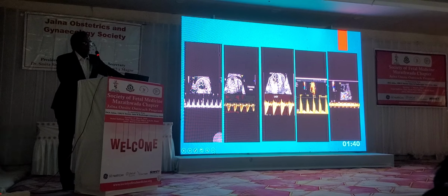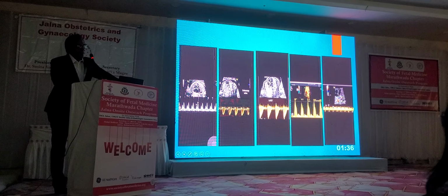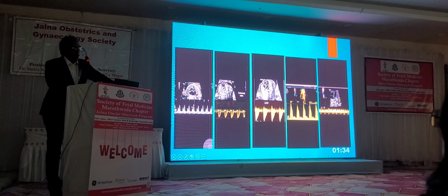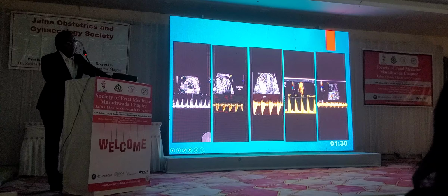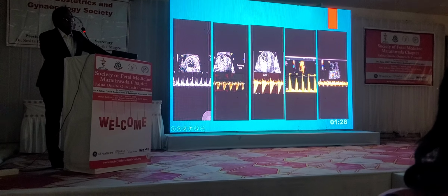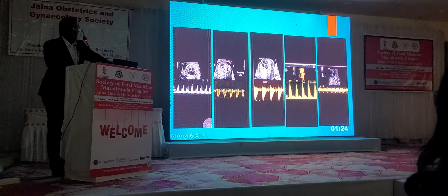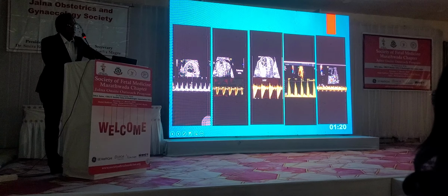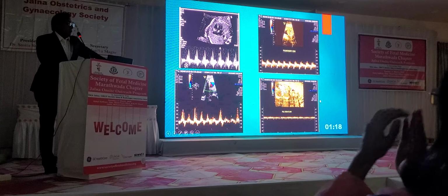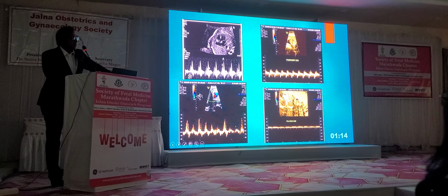This waveform is unique. This is of the ductus arteriosus. You can see two alternate triangles, one bigger and one smaller. That is the unique flow of the ductus arteriosus, and it shows continuous forward flow. This flow is something similar to the ductus venosus, but it is not so. It is the flow of the pulmonary veins, which mimics the flow of the ductus venosus actually. S, D and A waves: we have systole, diastole and atrial. Finally, the tricuspid flow, which we all discussed just now.